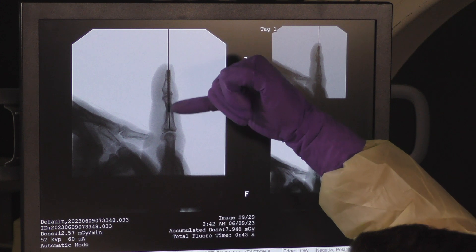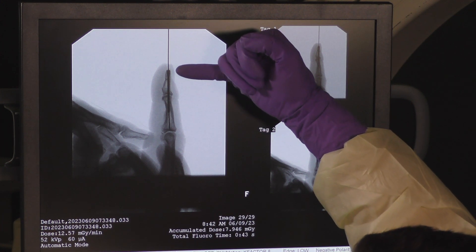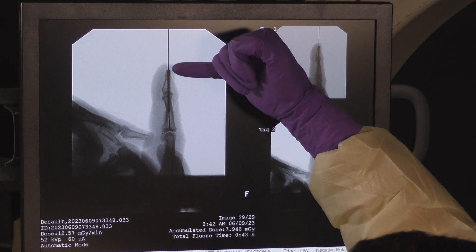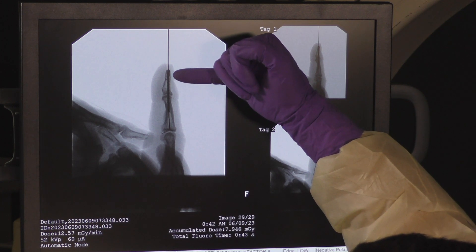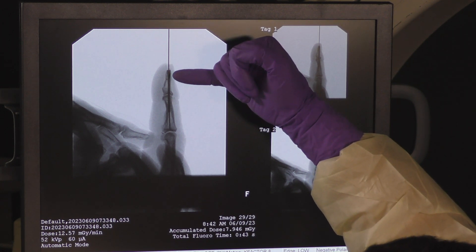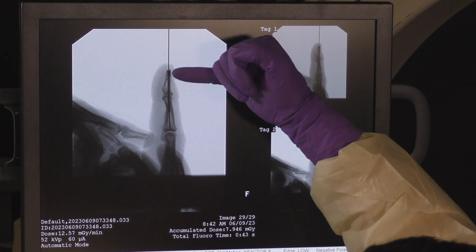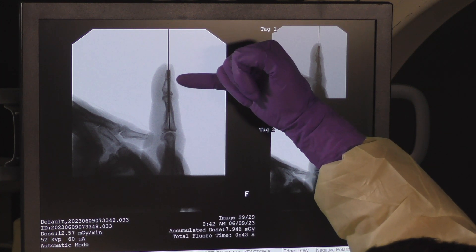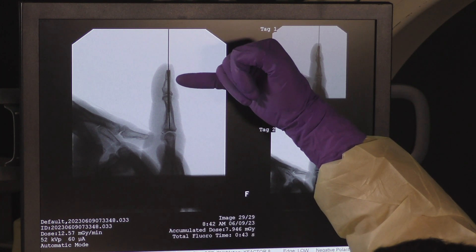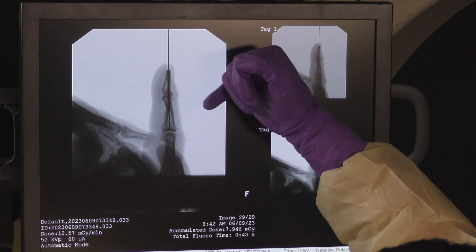On the lateral view, what I like to see is that the joint is nicely aligned and centered, and critically that the screw is buried within the distal phalanx with a nice ridge on the dorsal cortex indicating that the screw and threads are completely buried within the bone, so that there's no irritation of the nail bed from the hardware.